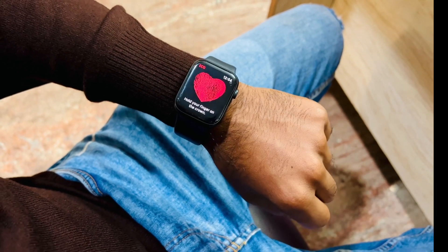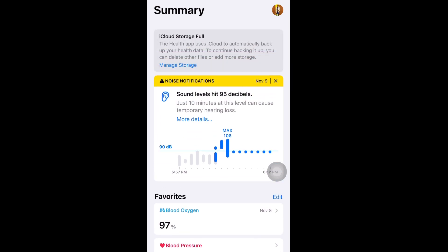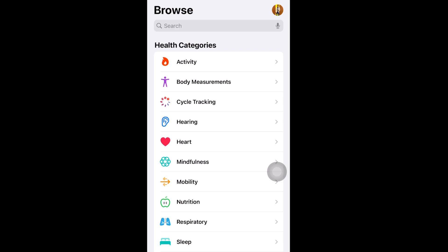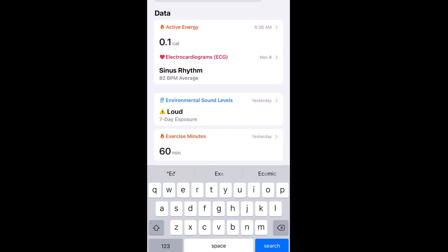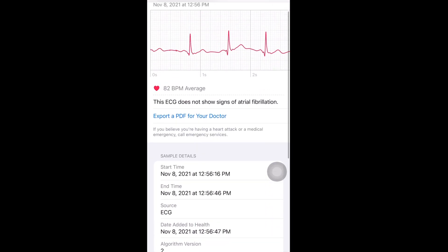On my phone it's showing the result now. First you have to go inside the Health app, and inside Health you will get the ECG result. Here you can see the ECG results, and this report you can export for your doctor very easily as a PDF file.